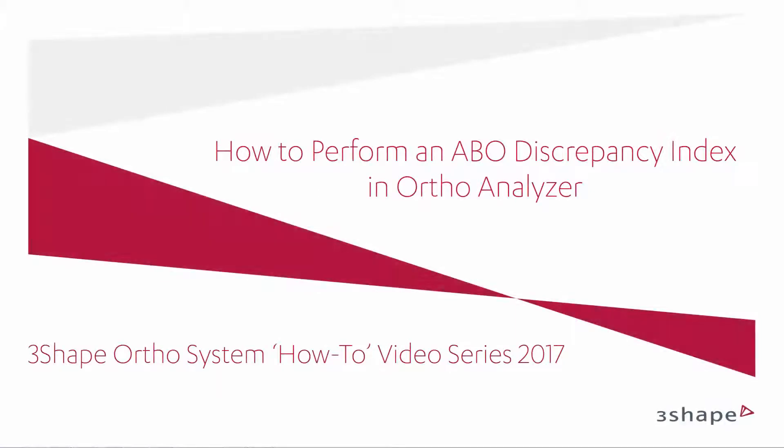In this video you will learn how to use the semi-automatic ABO Discrepancy Index scoring system. You'll also get a brief introduction to the ABO scoring and what it is used for.